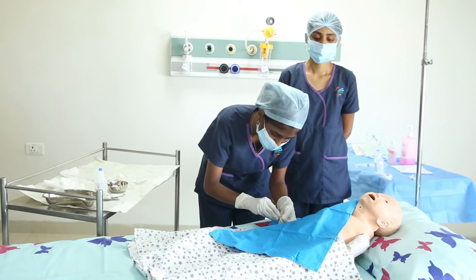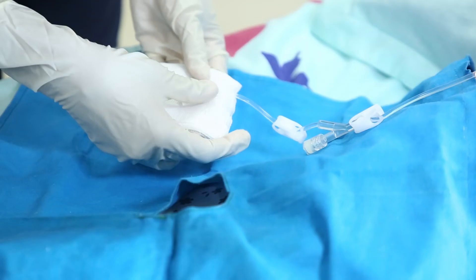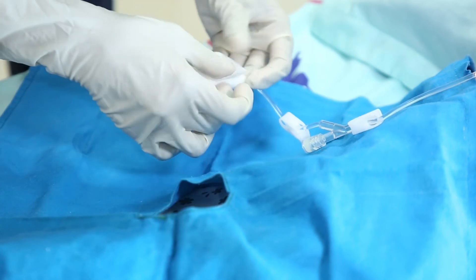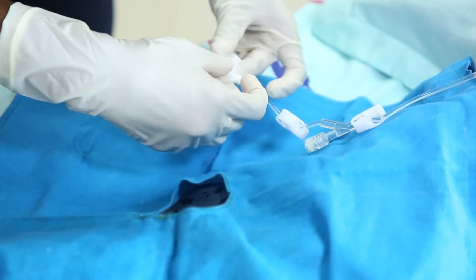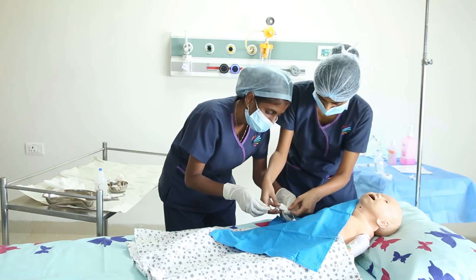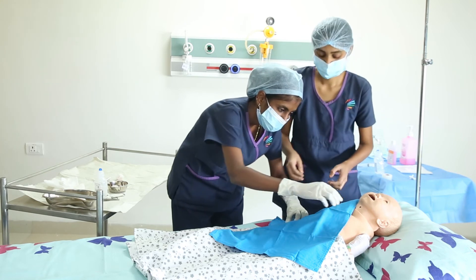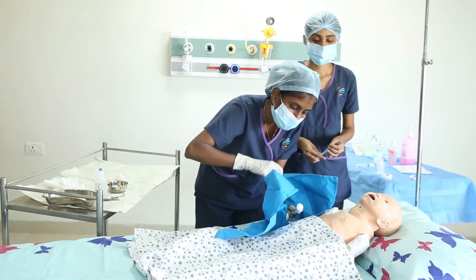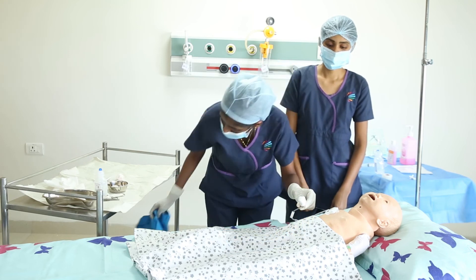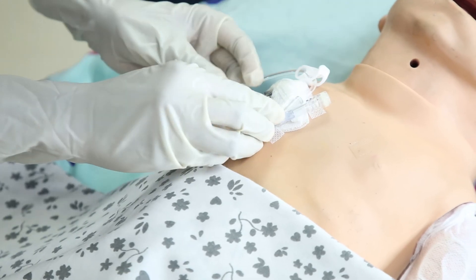Later, unclamp the extension tubing and gently flush again and connect to the IV set if any medications are needed. If we are not connecting to any IV infusion, then flush the line with hep lock and then clamp. Cover the hub with sterile gauze piece. We need to secure the portacath to the patient at a second site by taping to the skin. This will prevent any tension on the tubing or needle.